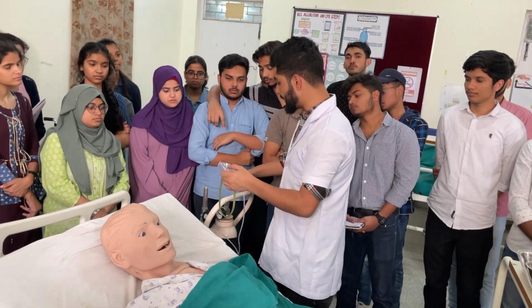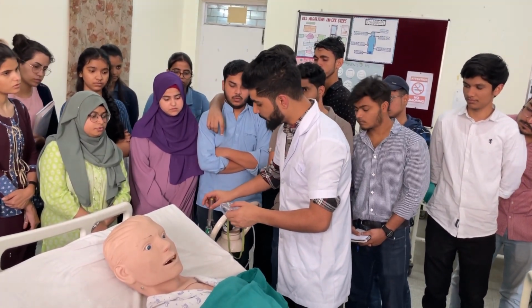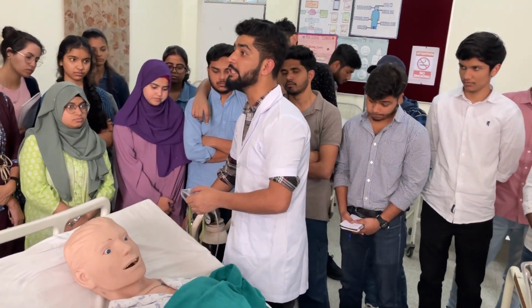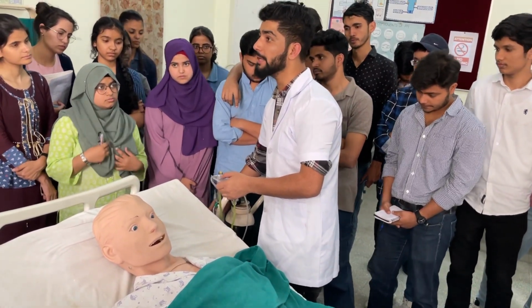How do we check the oxygen concentration? This is the valve. This is the pressure gauge. This is the flow meter. Okay. This is the humidifier cup, and the humidifier cup contains distilled water. It should not be filled to the maximum.